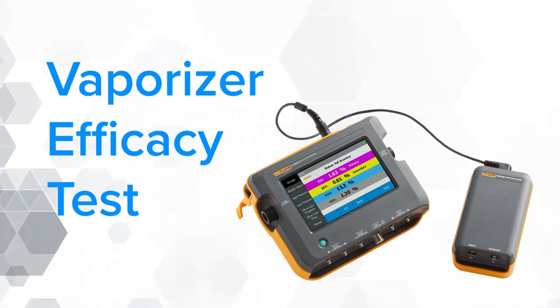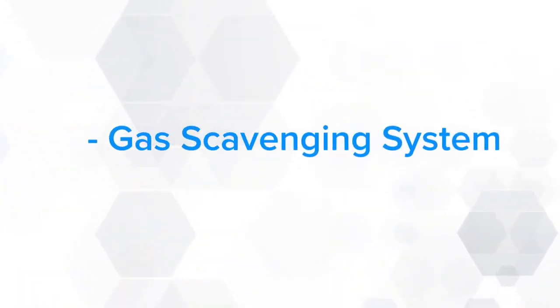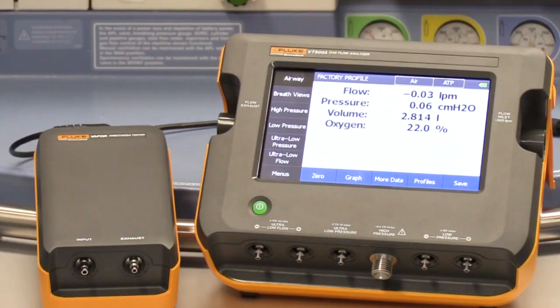Before we start vaporizer testing, we should ensure that the gas scavenging system is turned on and functioning properly. Also, many manufacturers ask that you manually inspect the interlock system so that only one vaporizer can be in operation at one time. Plug the vapor anesthesia tester into the VT900A via the connection in the rear.